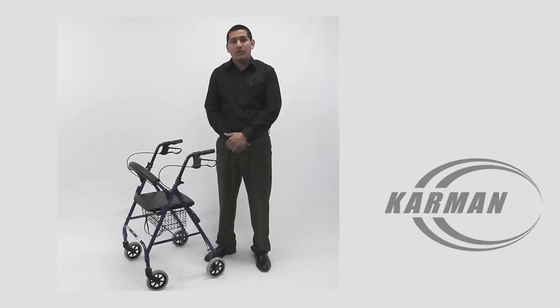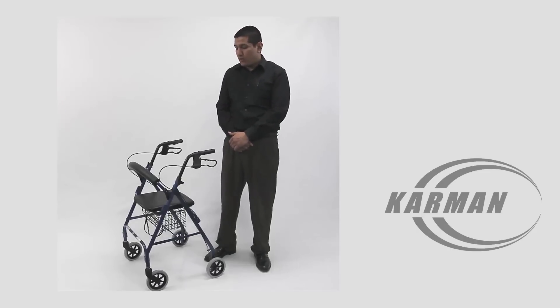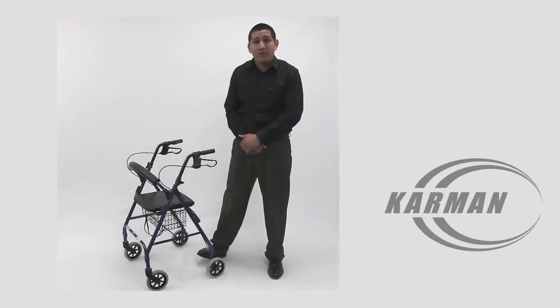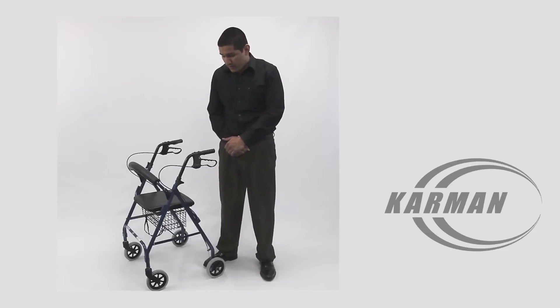Hello again, Edward here with Karman Healthcare. Today I will be demonstrating to you our model R-4600, which is a standard rollator available in a pearl blue or a rose red color.